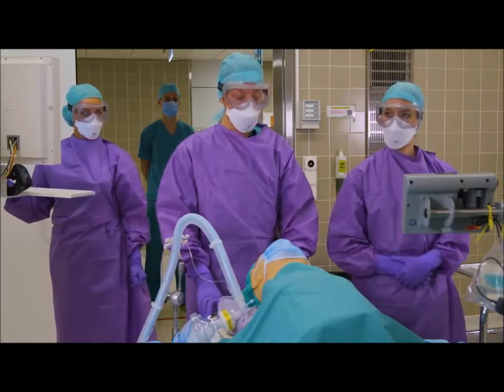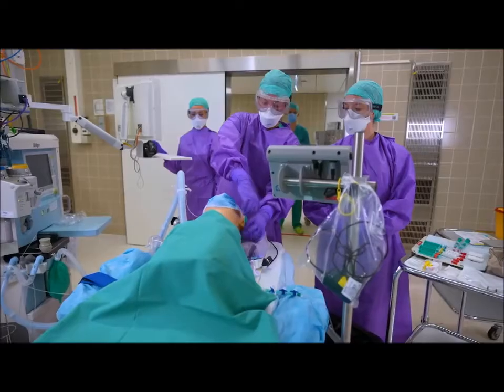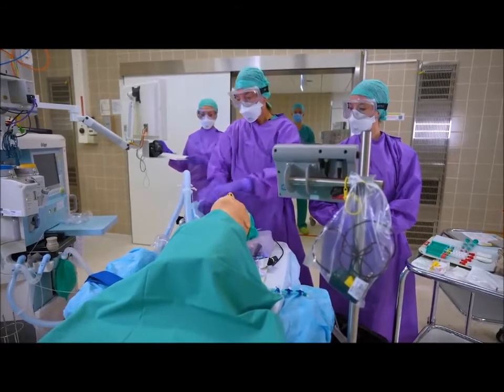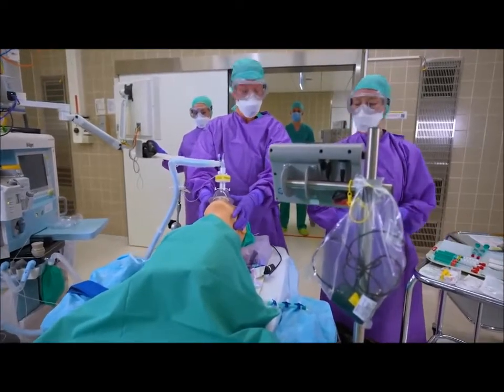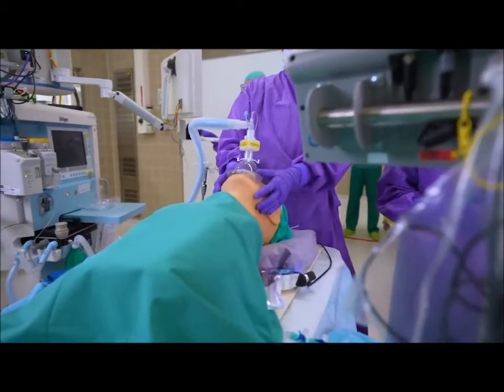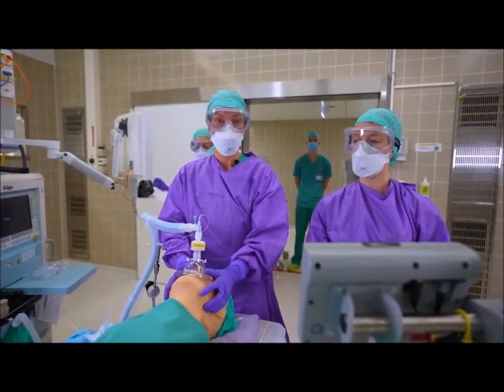We are starting with an adequate pre-oxygenation for about 3 to 5 minutes. As you can see, our patient is wearing a surgical face mask, which of course we have to take off. Then we will pre-oxygenate, and here it's important to have a tight-fitting mask to avoid any leakage. After a thorough pre-oxygenation, we are starting our rapid sequence induction.